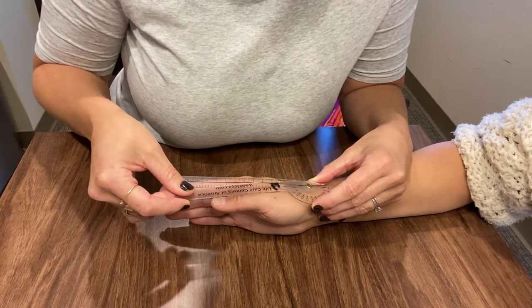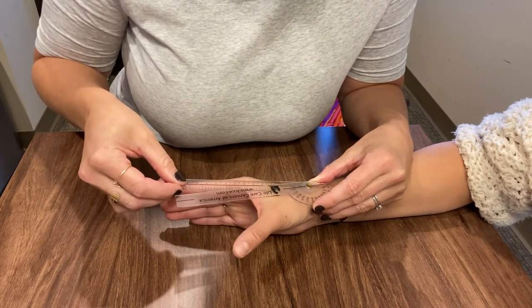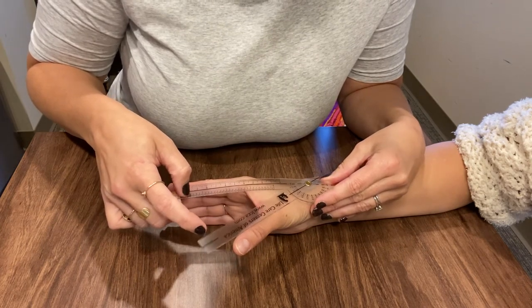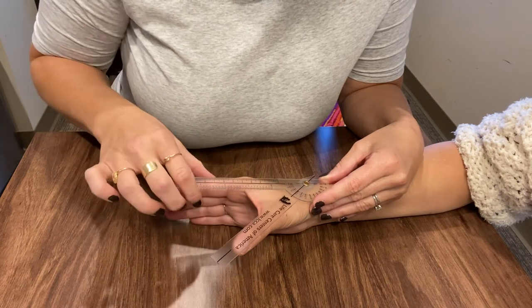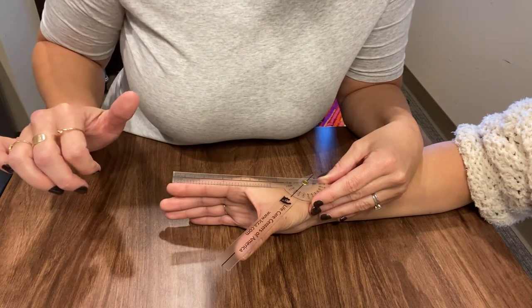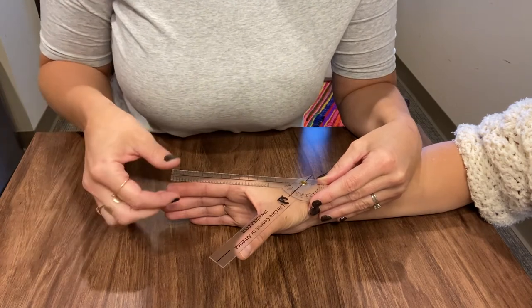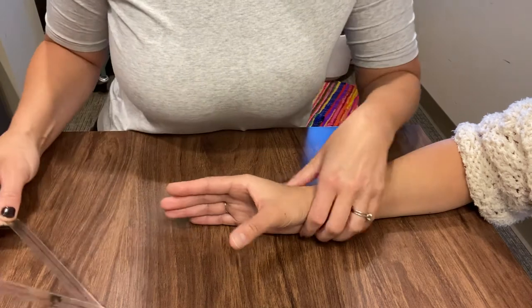She's at 10 degrees. Then I'm going to ask her to bring her thumb out and away from her palm. Normal range of motion is zero to 50. So we are at 55, meaning she has 45 degrees of total motion, because we started at 10 degrees at neutral.